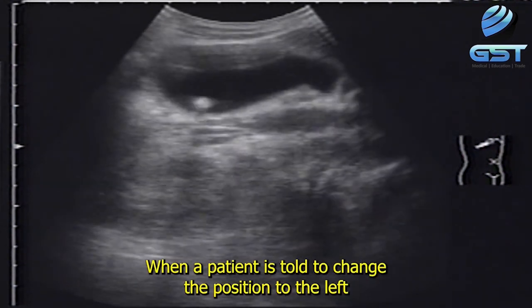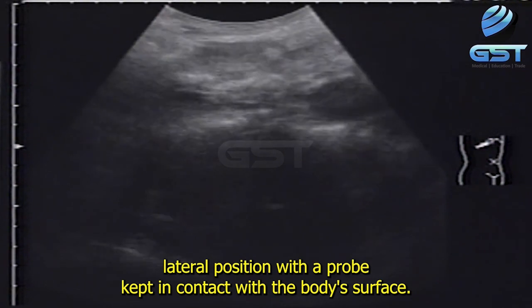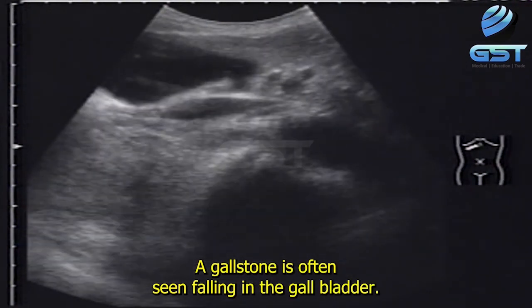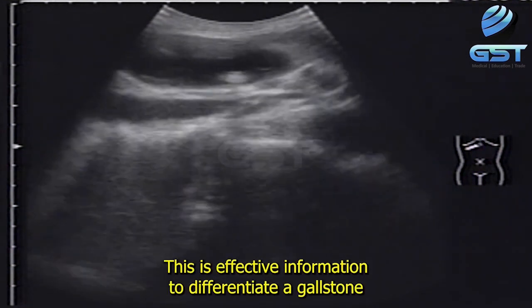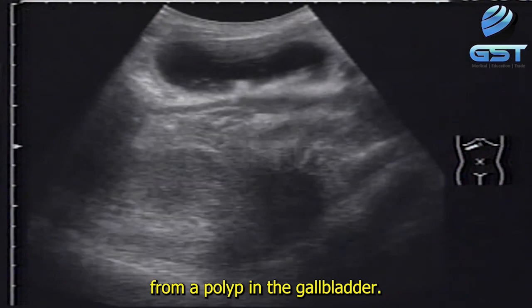When a patient is told to change the position to the left lateral position with the probe kept in contact with the body surface, a gallstone is often seen falling in the gallbladder. This is effective information to differentiate a gallstone from a polyp in the gallbladder.